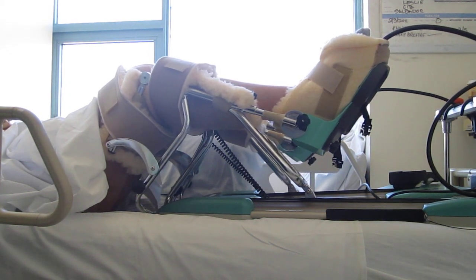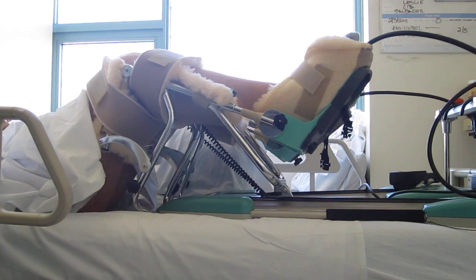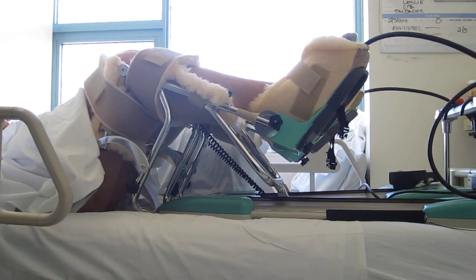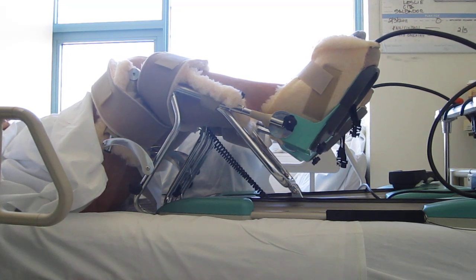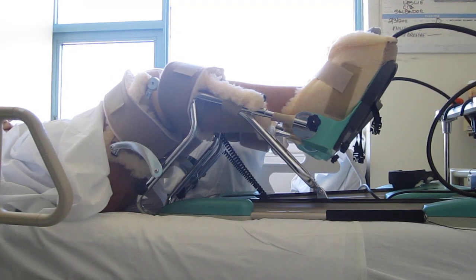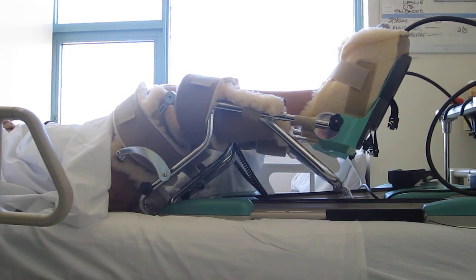The patient's recovery in this case is going really well. It's a bilateral procedure. The patient's pain threshold is fine and for the second day after the surgery, this is quite a nice result. The patient has been able to stand up and walk 10 steps supported by a walker and two physical therapists, and is also able to stand and use a bedside commode.